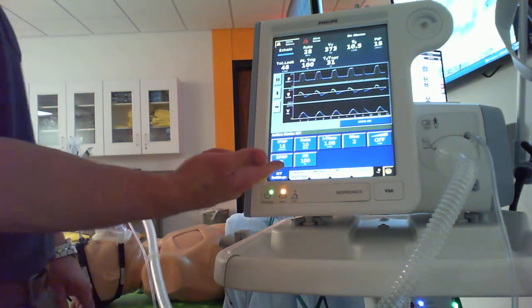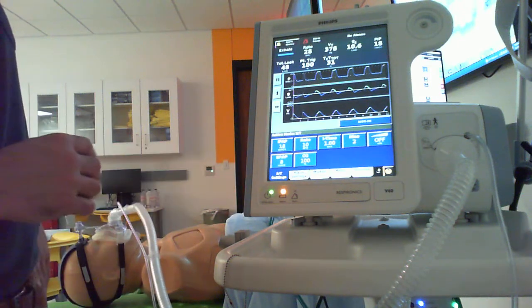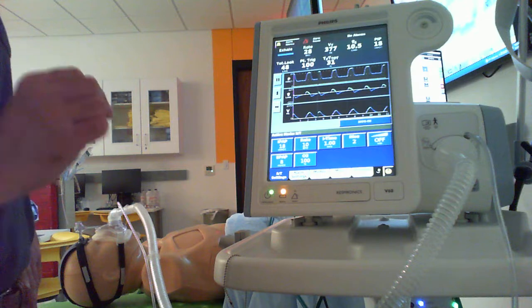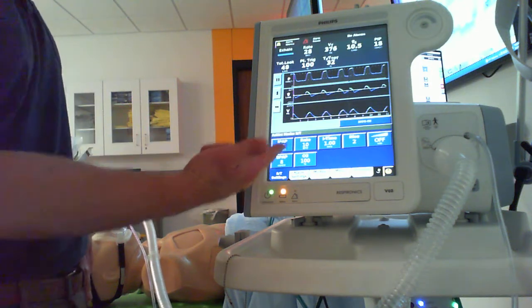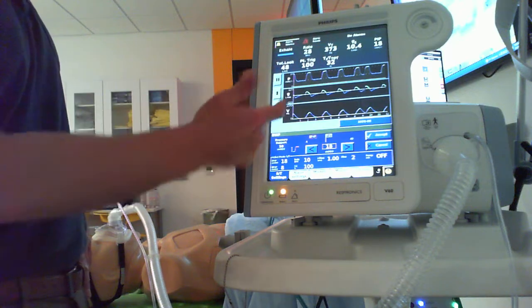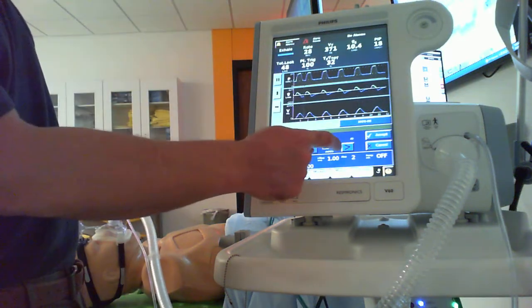So what I need to make sure of is, if I increase my baseline, or any change you make, think about what it does to pressure support and ask yourself, did you mean to change pressure support? All right, in this case, no. I was trying to improve baseline for oxygenation. I don't want to drop down here. I'm not going to reach over and make him breathe fast again. All right, but that's what would be happening: work of breathing would get worse.